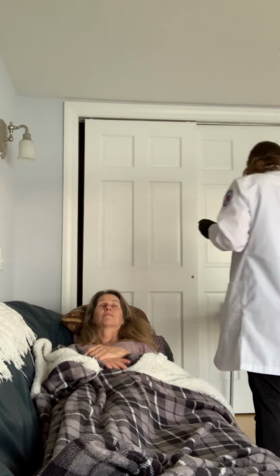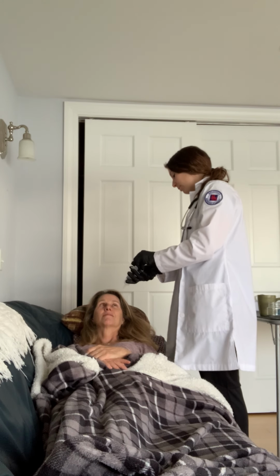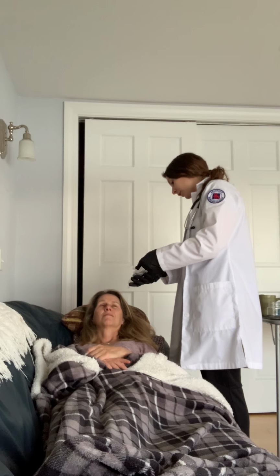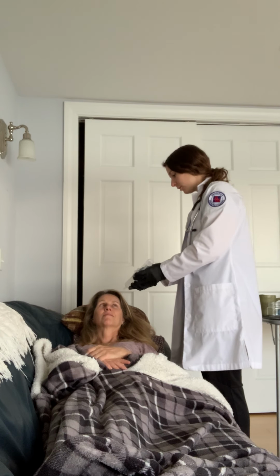I'm also going to aspirate and test the pH of the aspirate. So I'm going to take my syringe and connect it to the tube, her tube, and pull back on the plunger. You want to pull back until there's no more aspirate. If it's more than 60 milliliters, you would have to dump it into a container and continue to pull for 3 to 5 minutes if necessary. Okay, looks like I got everything, all the gastric residual volume. So I'm going to dump it into a graduated container.